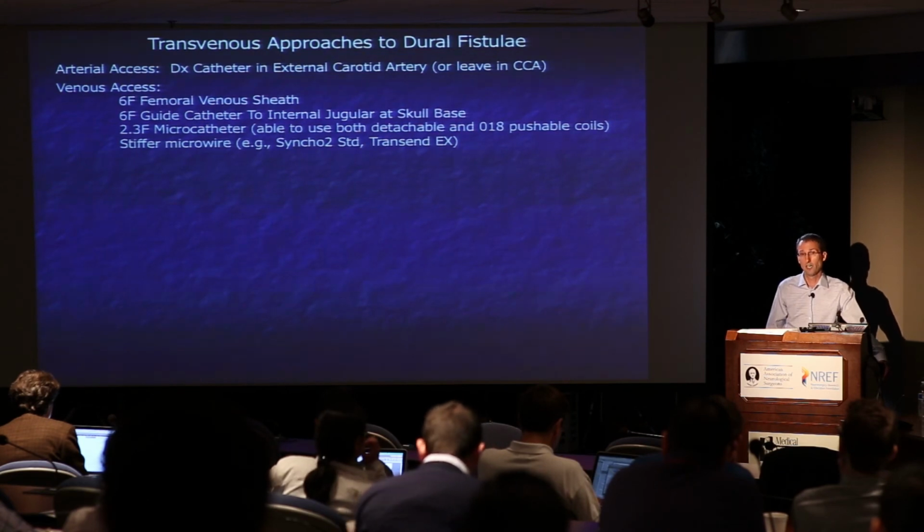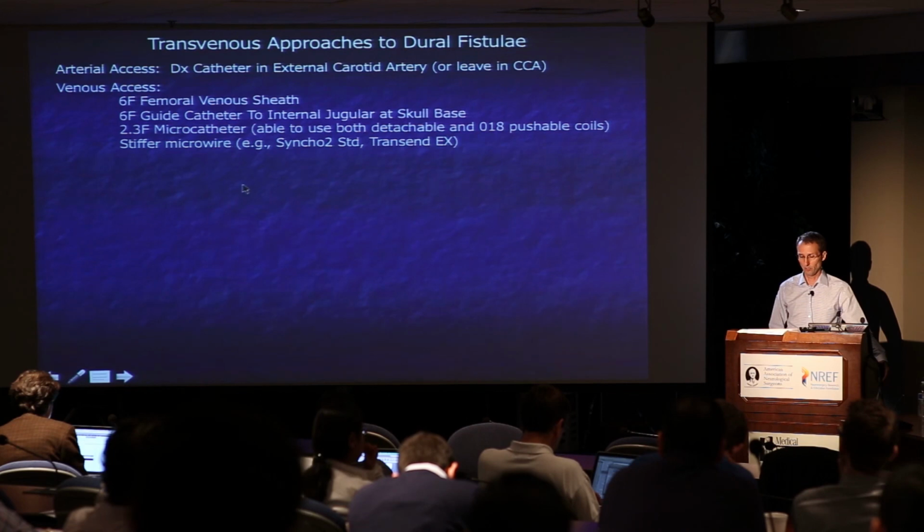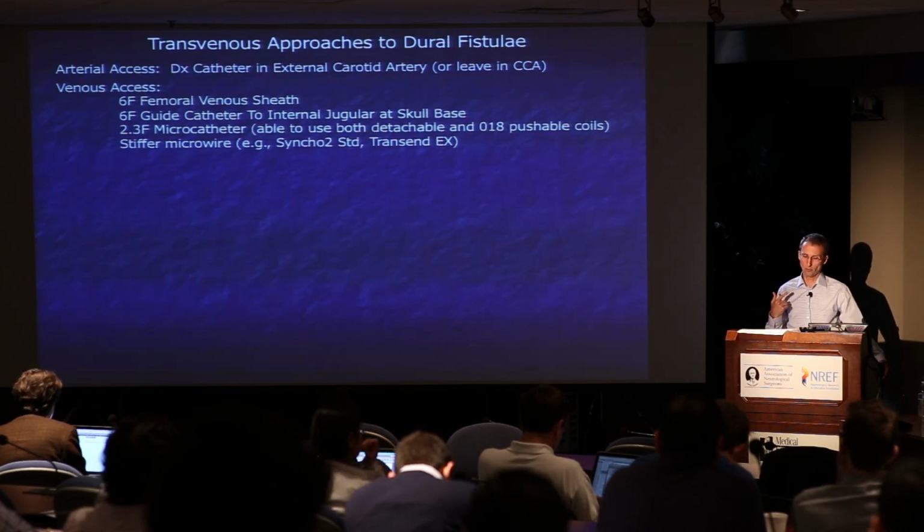You might want to let your anesthesiologist know that you're going to do that, or you can just see if you cause any sort of arrhythmia and they look up from their sort of crossword puzzle. I usually tell them you're going through the right heart.